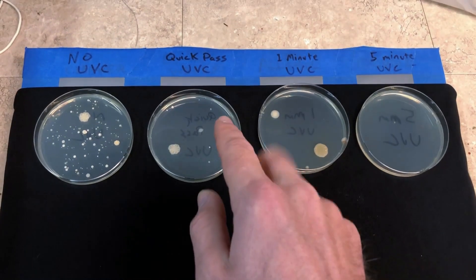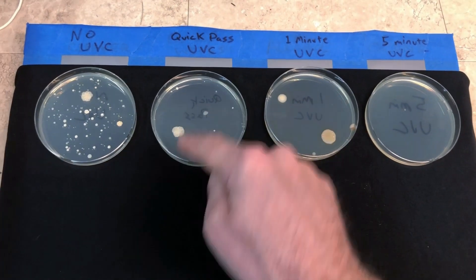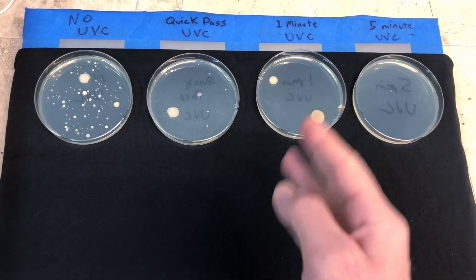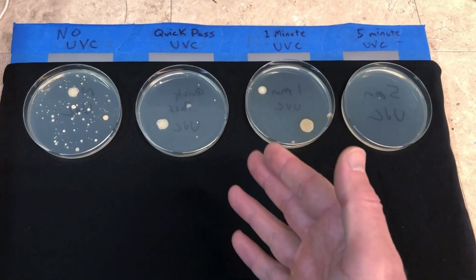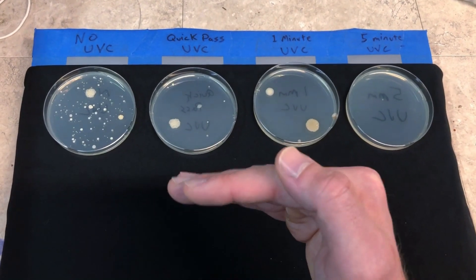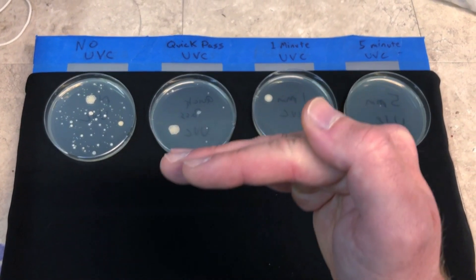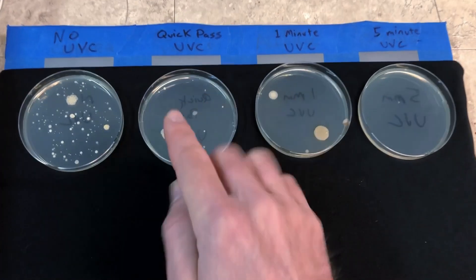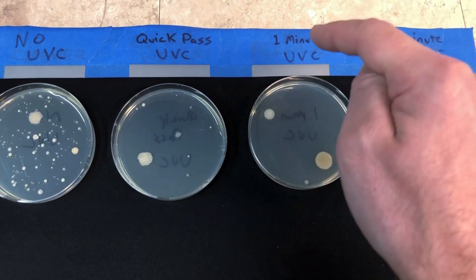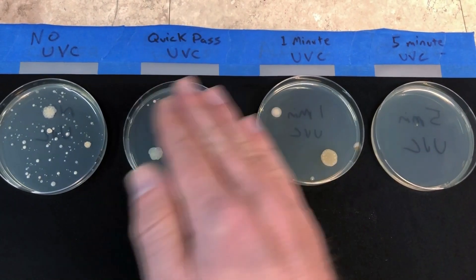The reason we're seeing the same result between the quick pass and the one-minute exposure is because proximity matters with light sources. There's something called the inverse square law — if you double the distance from an artificial light source, you don't double the reduction in intensity, you quadruple it. The quick pass was about two inches from the surface, the one-minute was eight inches away — that's a significant reduction, which explains why it took 60 seconds to match roughly two seconds of exposure at close range.